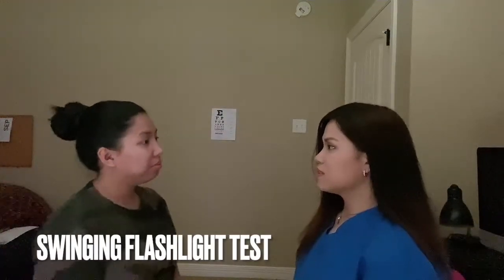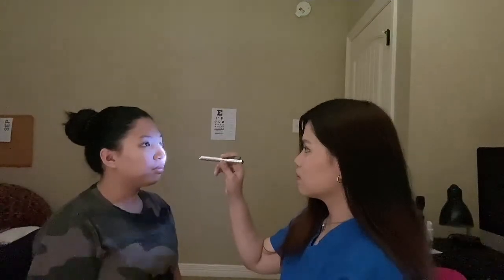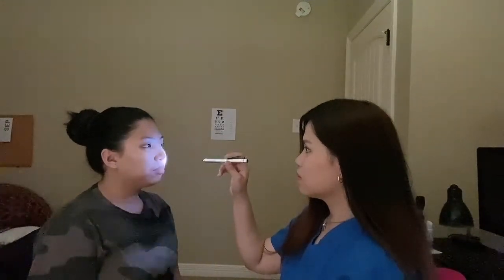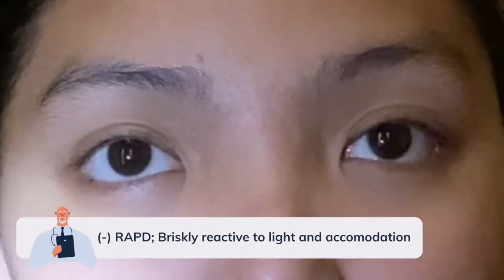For the normal swinging flashlight test, we begin with a dark room. Let the patient fixate at a distant object. We then shine the pen light into the right eye and swing to the left eye and swing back to the right eye. Both pupils should remain constricted.